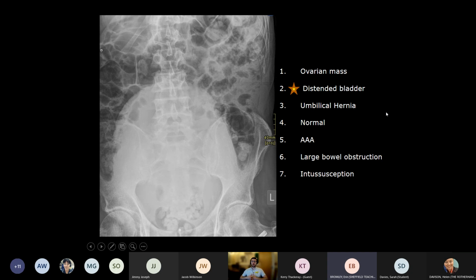That's the problem. We're reliant on the clinical information provided, and it's often very vague. Whereas they've got the patient in front of them, they can see if it's working or not. Adjust the catheter. If they get a lot of wee out and it's still like that, then we'll do some further imaging and take it from there. Thank you.